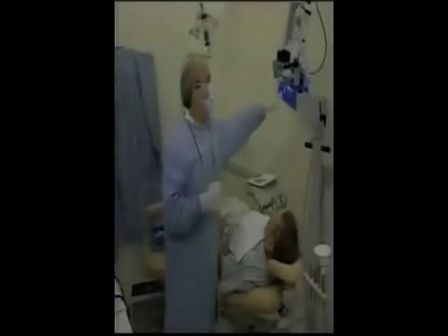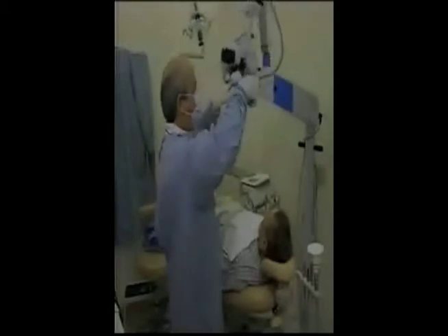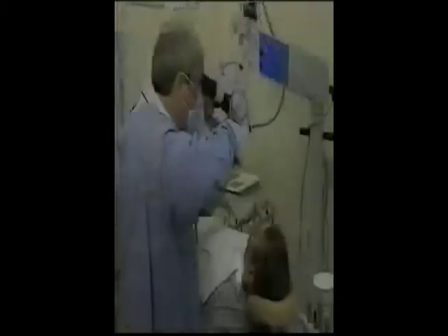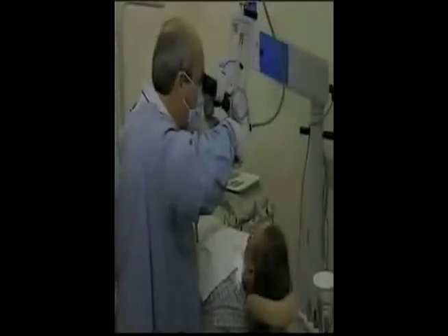But first, let's look at how a surgical operating microscope works and the special features that make Molar's Universa 300 an outstanding value in operating microscopes.